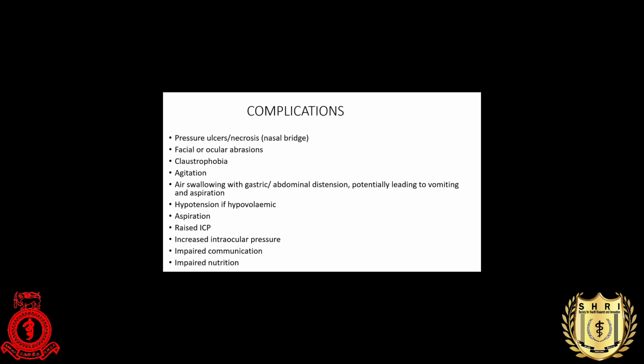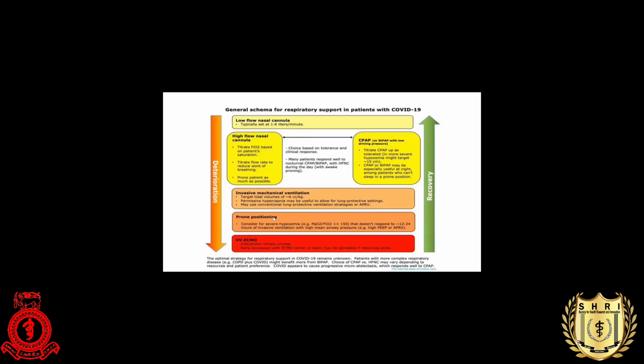This is my last slide, a summary of the overall management of COVID patients. We start with low flow nasal cannula, and then if the patient deteriorates, we have to escalate to high flow nasal cannula or CPAP mode.